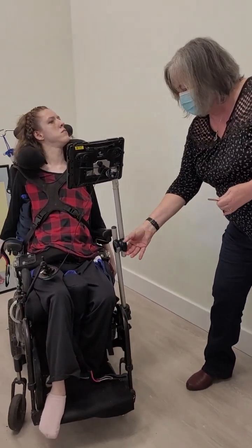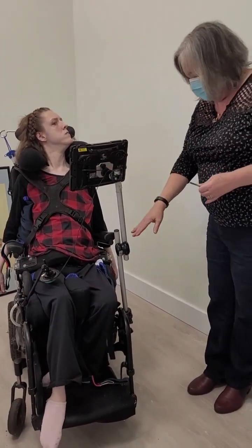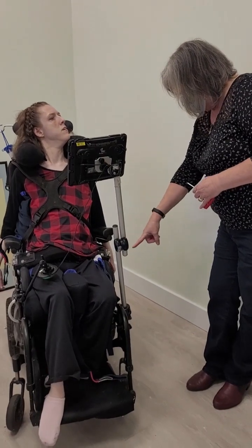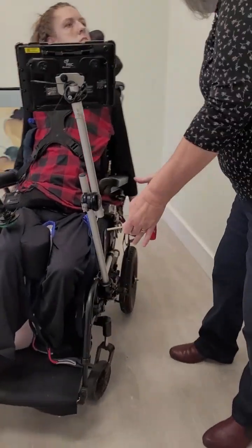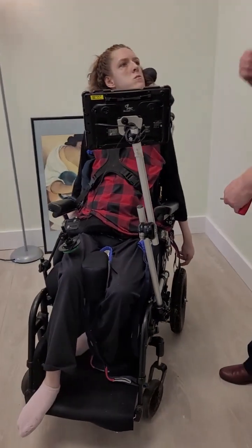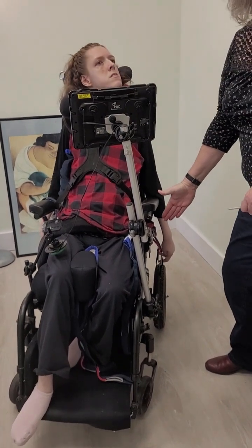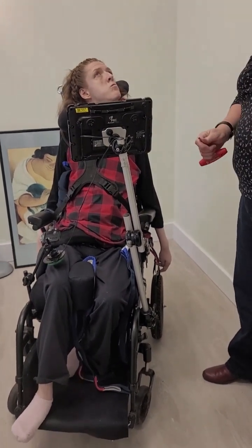Same story here — try not to adjust the height. The height is where it's supposed to be, and the same with this distance. Sometimes people are tempted to put it closer to Julie, but it doesn't work closer. It can't go further away either — we're pretty much maxed. And if it does end up loosened, that's a good way to remember where it belongs: it's all the way out.